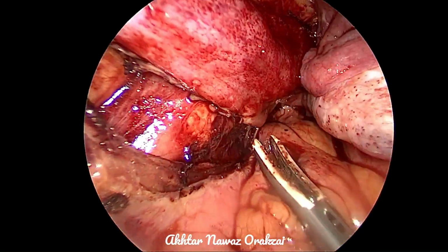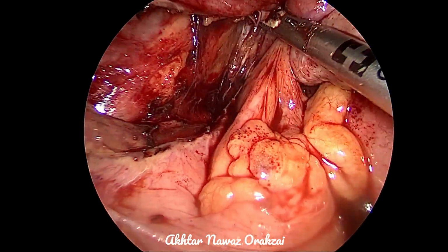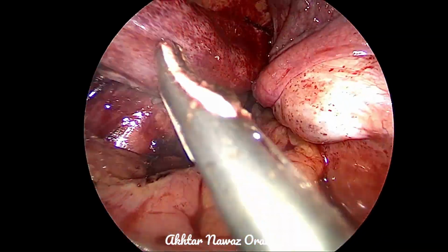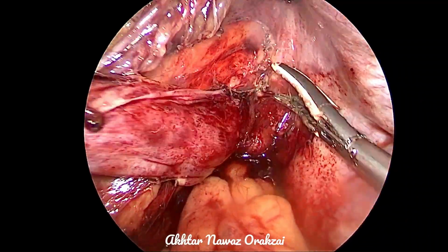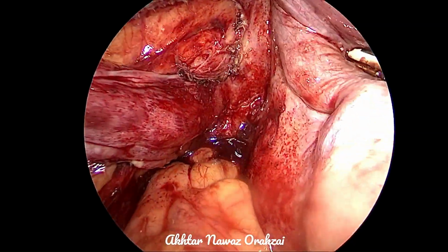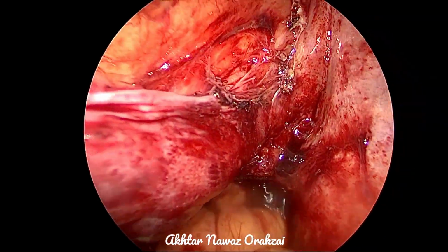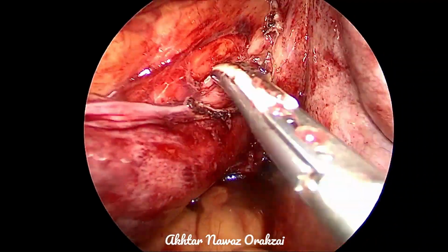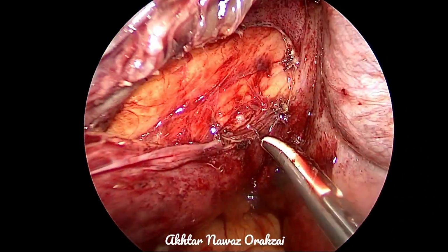So keeping in view the vascularity, we have to mobilize the ureter, and some blunt dissection will also be performed and small vessels will bleed. We don't mind those small vessels because if we coagulate them, this will also lead to ischemia of the ureter.